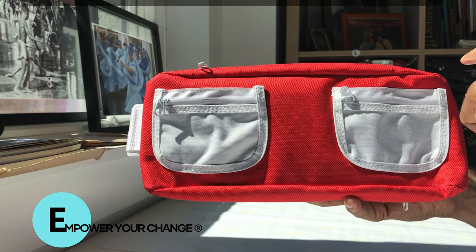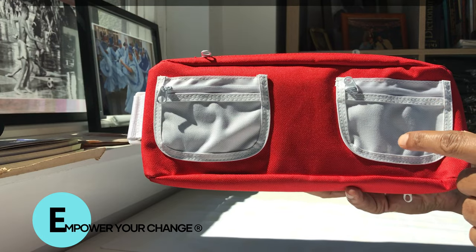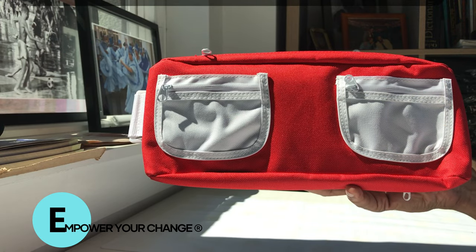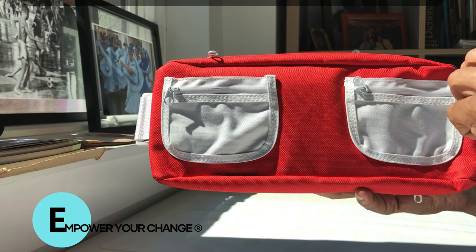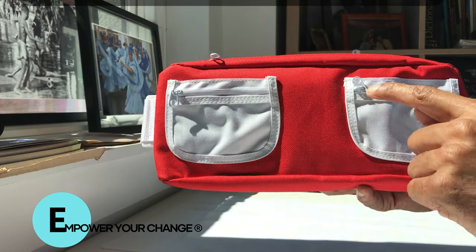Hello ladies and gentlemen, today we're going to demo one of our new products — the Ostomy Active Guard. It's releasing effectively in June. The product is designed by Empower Your Change and it features two pockets in the front.